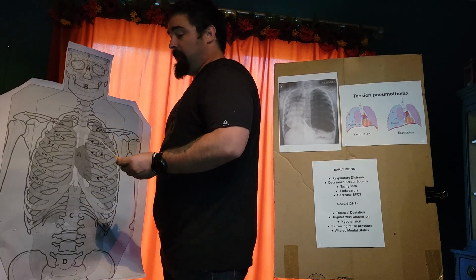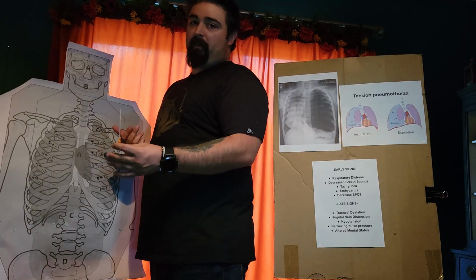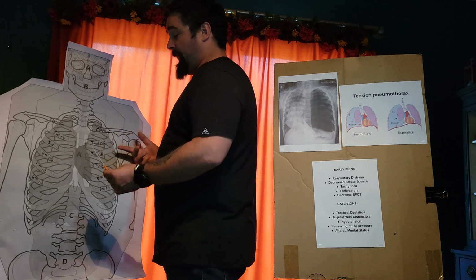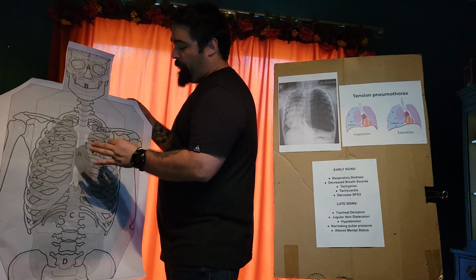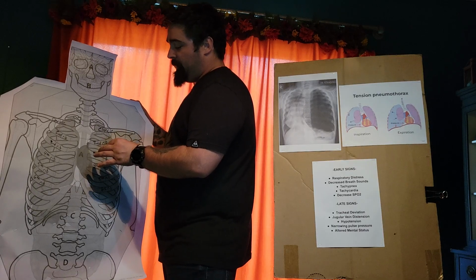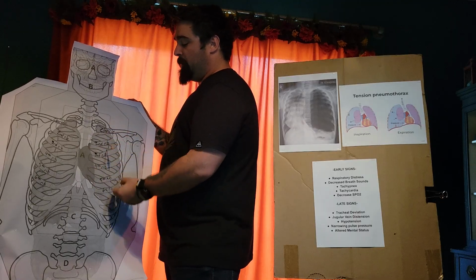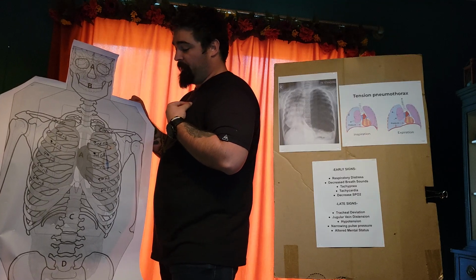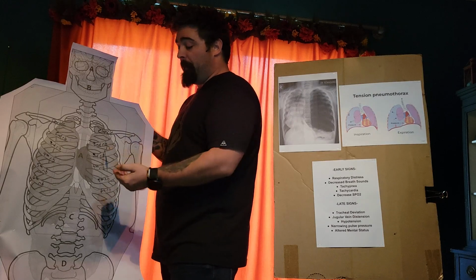We're going to pierce 90 degrees to the patient, depending on how the patient's sitting. If he's semi-Fowler's, if he's supine, we want to go 90 degrees to the patient, so we have an anatomically correct stick. So 90 degrees to the patient, we're going over the top of the third rib into the second intercostal space. We are going to push and pierce. We're going to go through the chest wall, through the adipose and musculature. You will typically feel a pop where you're entering into the pleural space with the needle. You may also hear a hiss or a pop.